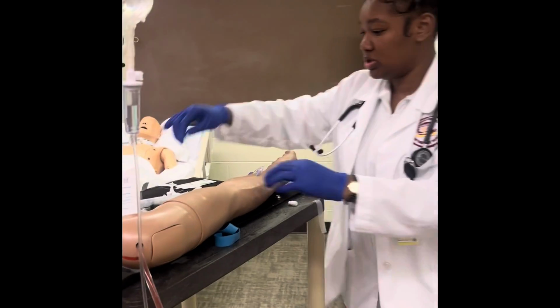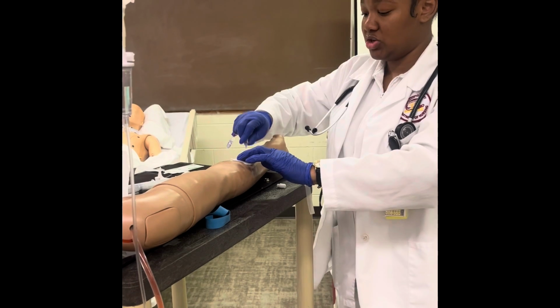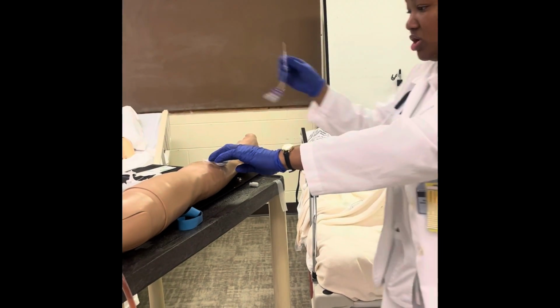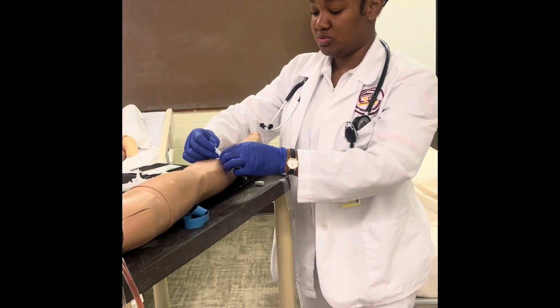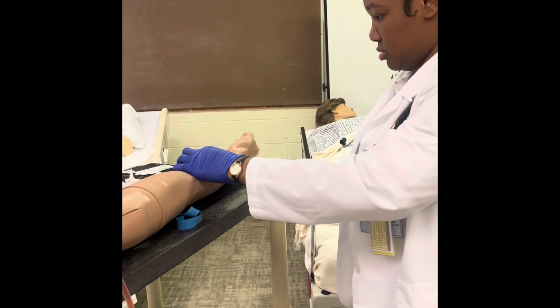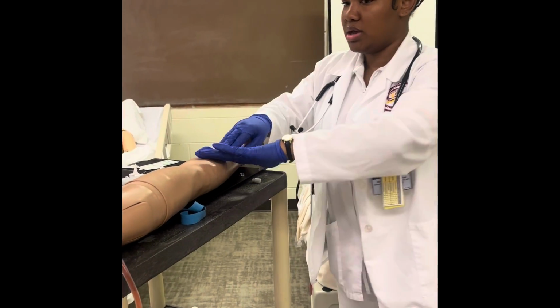Okay, gently pull the needle out and put some gauze on it, because some patients will bleed. Put this in a sharps container, and then I can tape it off, because some patients will bleed for a while, and we don't want them to get blood everywhere. All right, and those are my skills.